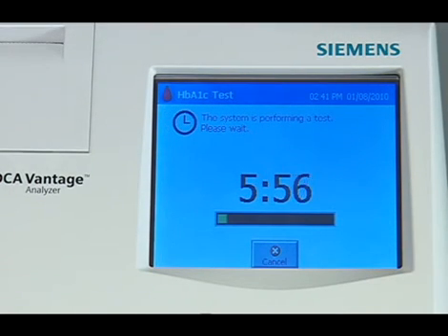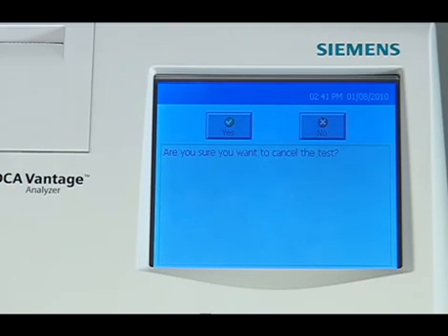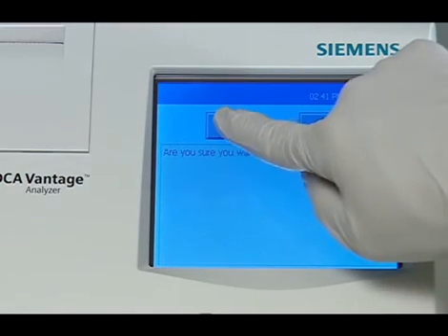You can cancel a test at any time. To cancel a test, select Cancel. Note: if a test in progress is cancelled, you must discard the reagent cartridge.